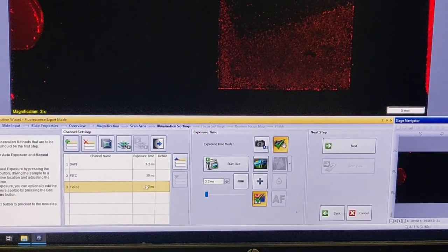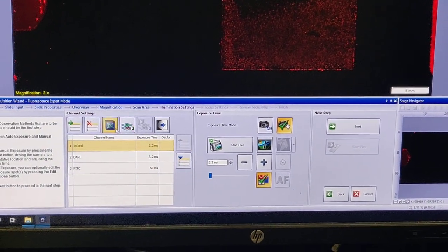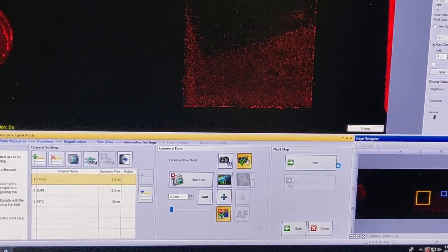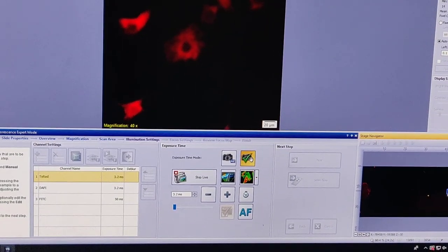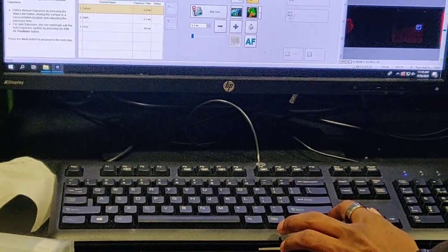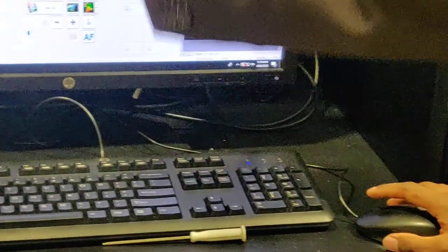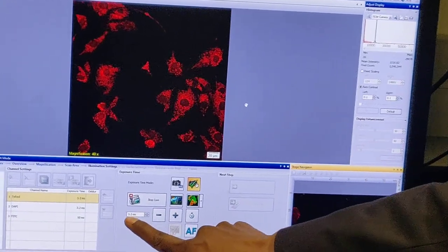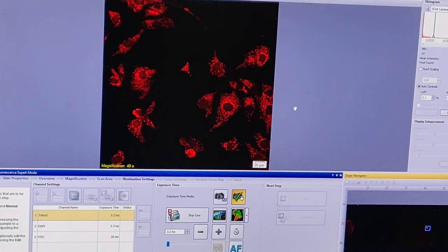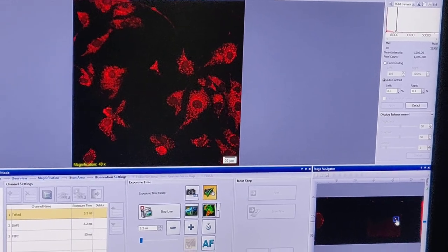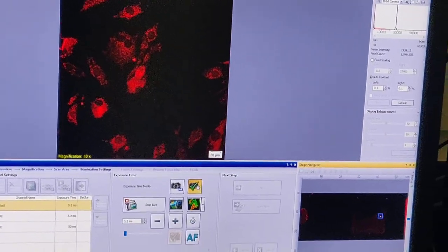Since I have the liberty here, I'll bring Texas Red to the top and start live view. I navigate to my sample. The signal looks pretty nice and bright — 30,000 units — at the fastest imaging speed of 3.2 milliseconds, which is the minimum exposure you can set. Even moving around the sample, intensity remains very bright. It's actually maxing out.